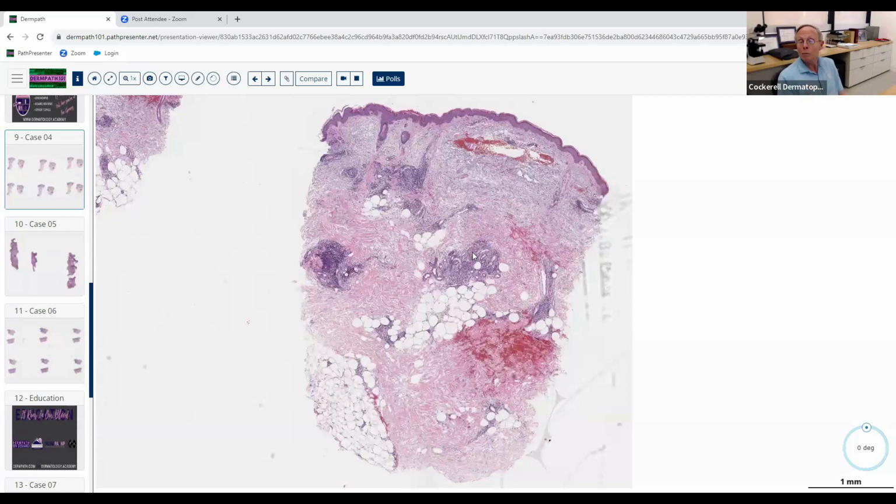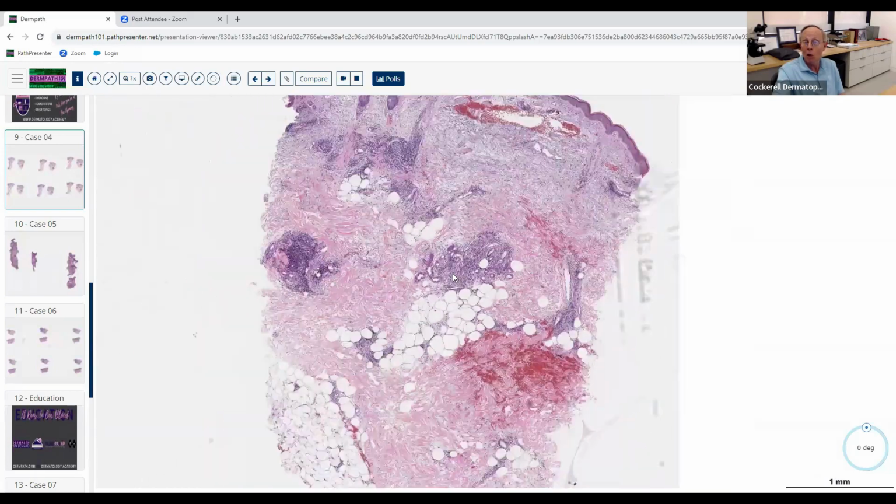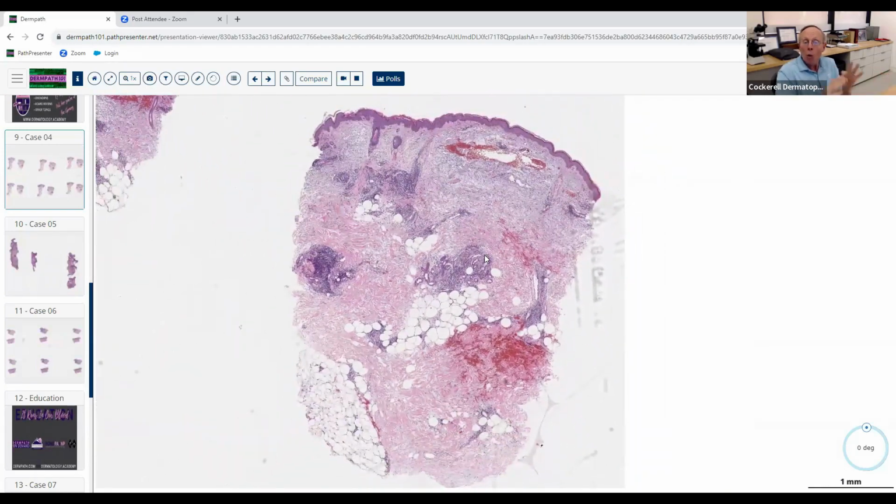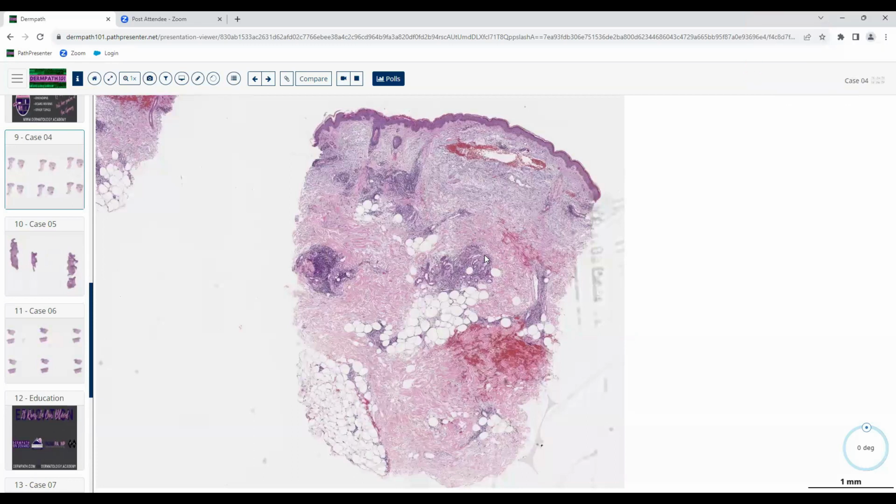Now, that's good news, because that really hones the differential diagnosis down into about 8 or 9 different things right there. So you can throw out 1,000 things. There's only about 8 to 9 things that can give you a superficial and deep infiltrate with lymphocytes at low power. So what do you think about here? Before we go to high magnification, what are some of the things that you're going to throw into the differential diagnosis of that pattern? I think of lupus.